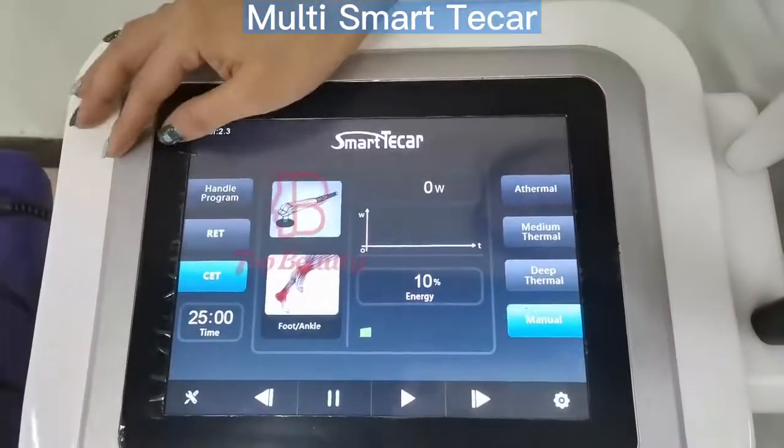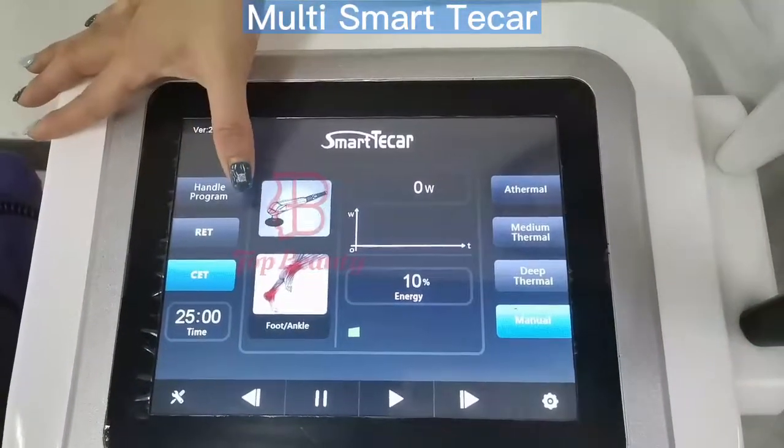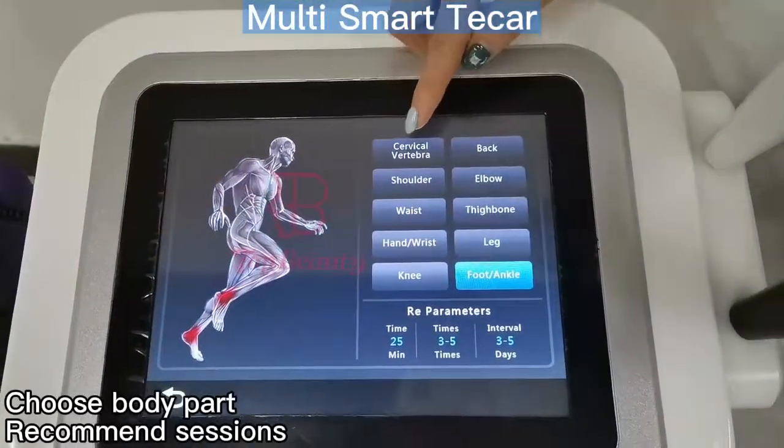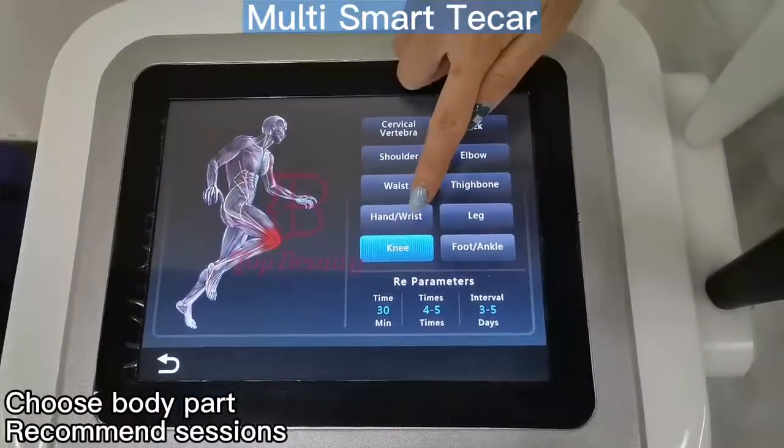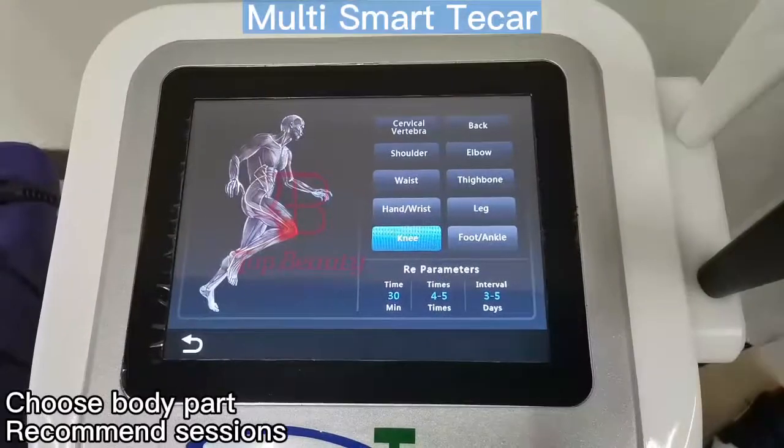This is the RET and CET — these two buttons to exchange the RET and CET functions. And here it comes with 10 treatment areas, so as you can see we change different treatment areas and it will show you different treatment details for reference.